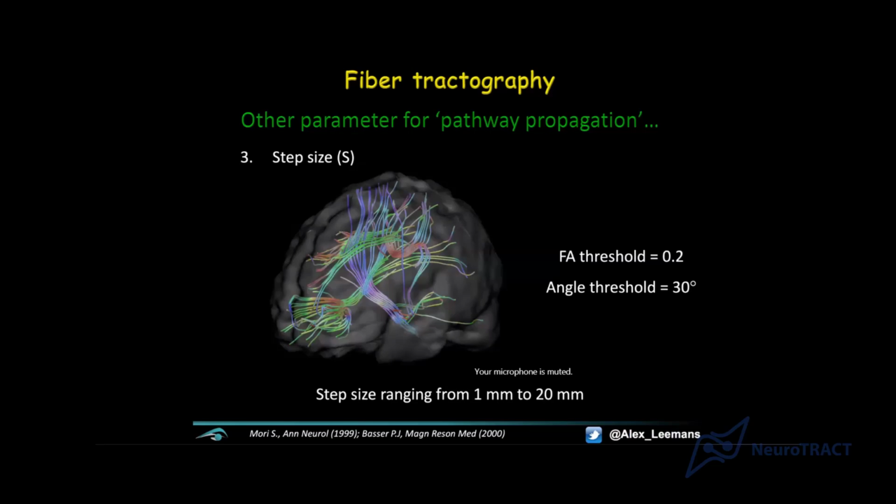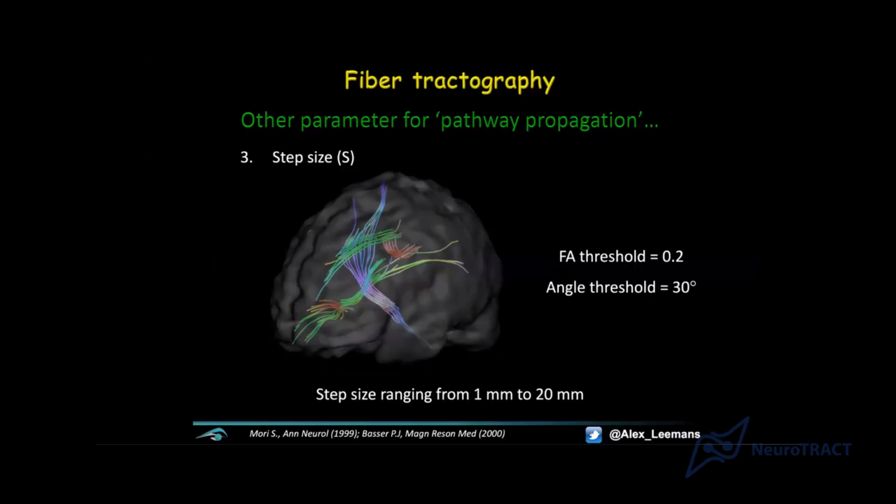All right. So I was going to show the animation here. What I'm going to do is start this movie loop, and every frame now is basically using a step size which is a bit higher. So I'll start off at 1 millimeter, and we're going all the way to 2 centimeters, to 20 millimeters. Okay, this is what happens. Okay, so you can see that changing the step size, and especially going to bigger step sizes, will drastically change the outcome.